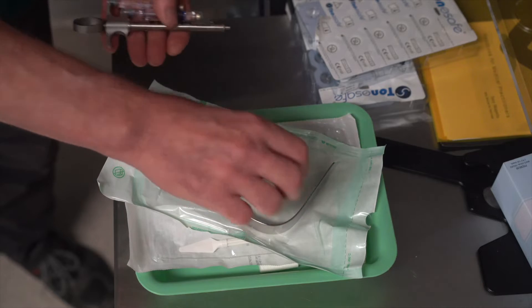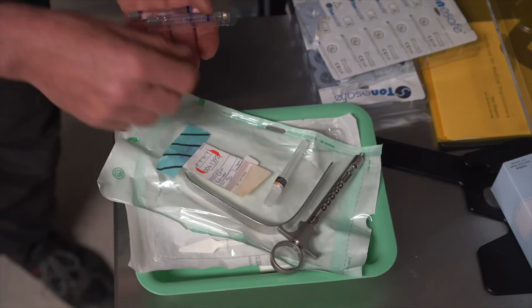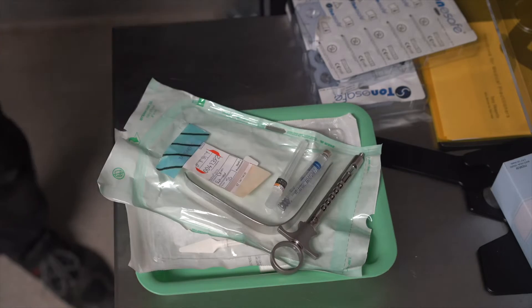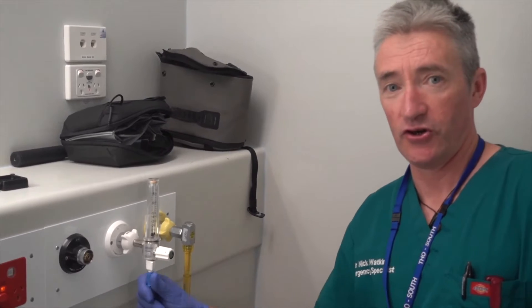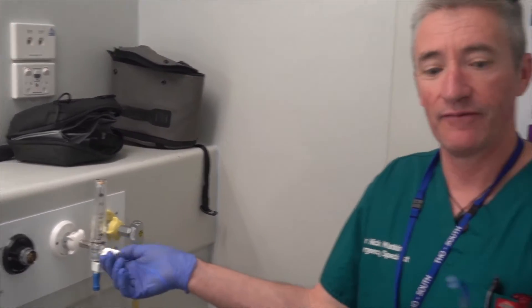You'll frequently find that it's easier to wash out a molar tooth if there is some local anaesthetic. To dry the tooth in any of the treatment spaces you can just attach the suction tubing to the oxygen or air outlet.